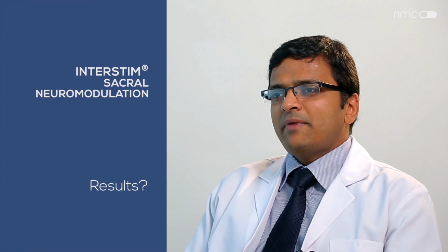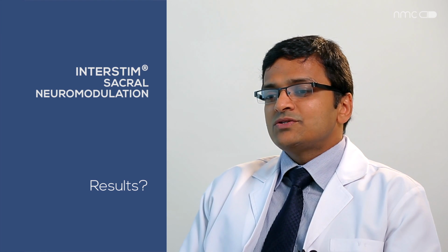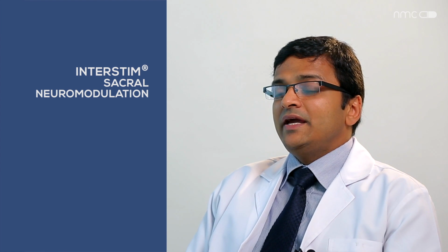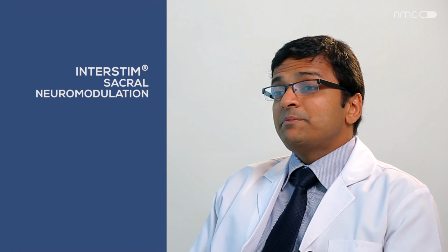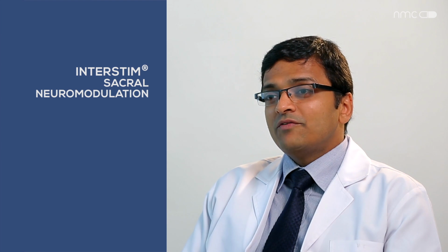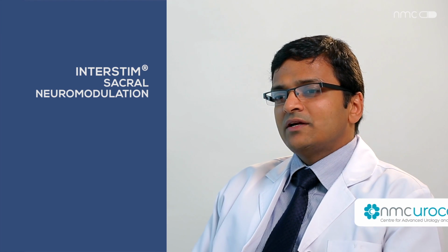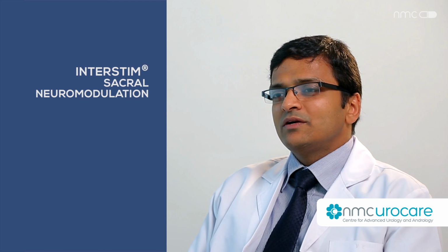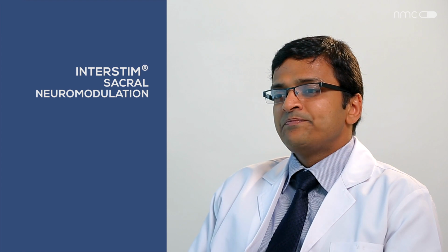Sacral neuromodulation has again revolutionized the management of these voiding problems, particularly urge incontinence. And in patients in whom it is implanted, like those who have failed the earlier forms of therapies, it makes a huge difference in their quality of life. Up to 70% to 80% of people with urge incontinence feel much benefited. The results in the other groups, like pelvic floor spasticity or pelvic pain, are not as promising, but still, before going for a large mutilative surgery, it is worthwhile trying this before going for it.